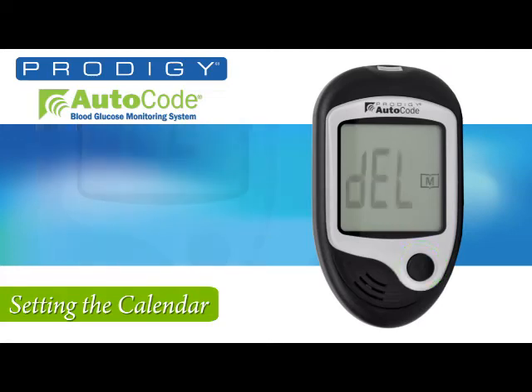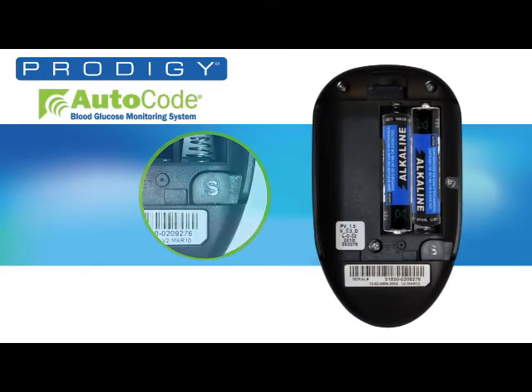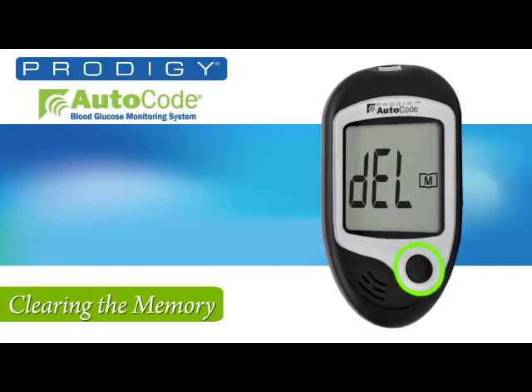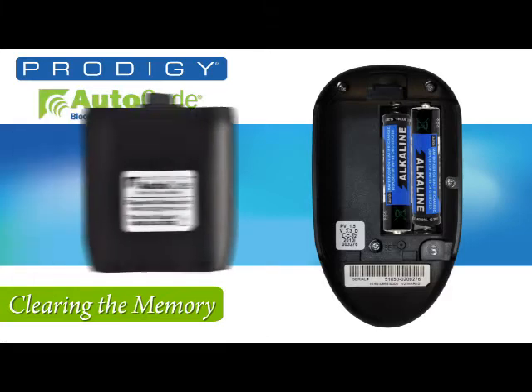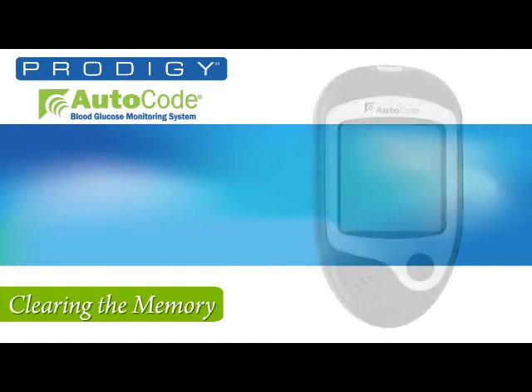The final step before you get started using your meter is to once again press the SET button. If you want to clear and delete all of the records, press the M button. If not, simply press the SET button one more time and the meter will shut off, retaining your information. Now snap on the back and you're ready for the final steps to start using the meter.